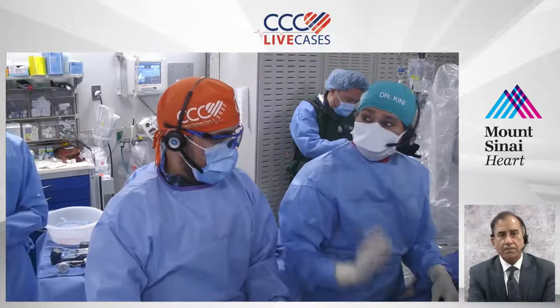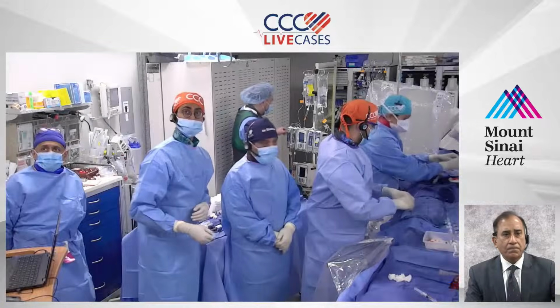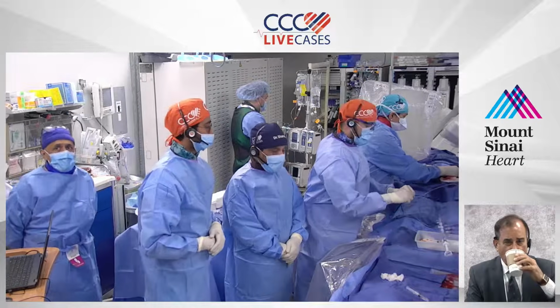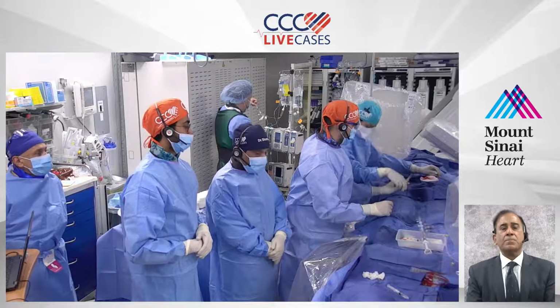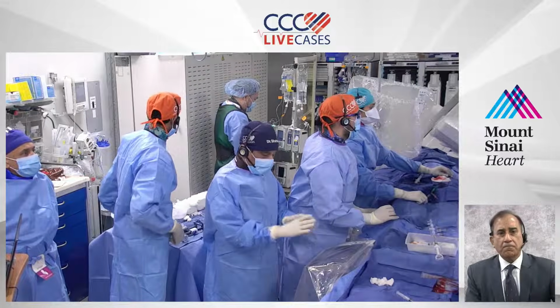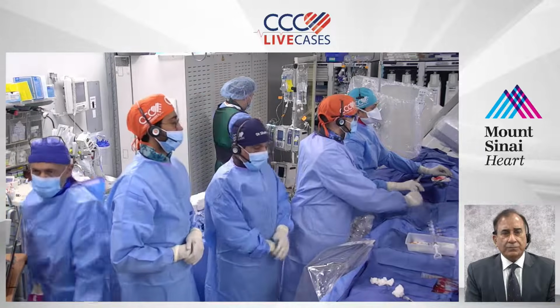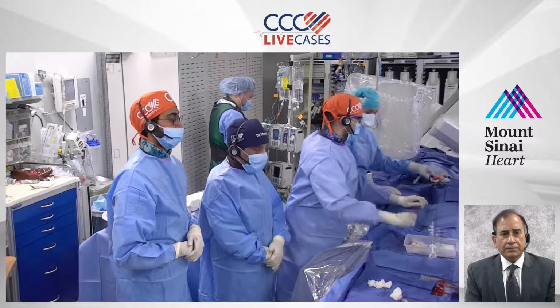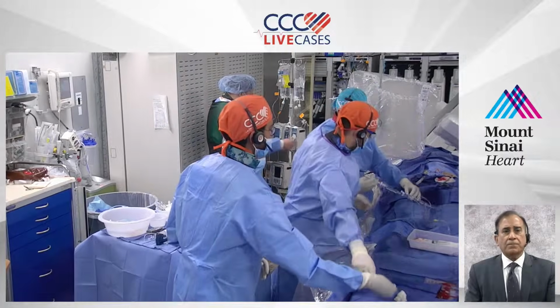And again, something different we are showing today, and that will be basically this underexpanded stent. Actually, it is my technique of SKS, simultaneous kissing stent. We did it for restenosis at that time, then went for CABG. Then the graft to the diagonal is good, but the LIMA to the LAD, which supplies it, is closed. So now we have to tackle the old SKS, which is the two-layer carina, and we are going to show with the imaging and the angiogram how it looks and how we need to treat.